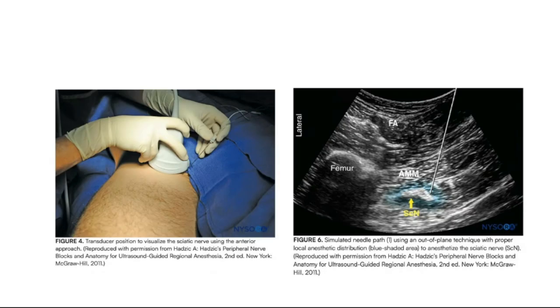A lot of times, it's difficult to do an anterior approach with an in-plane technique in the sense that you need a very long needle. That one is just geometry. So it is best to use an out of plane technique so that your needle pass is much shorter. But of course, number one, you need to use hydrodissection to be able to identify the level of your needle.